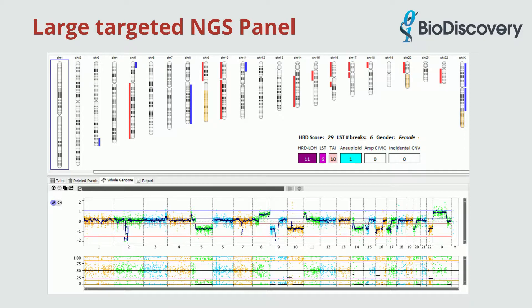In NX Clinical, the genome-wide visualization of chromosomal aberrations is similar to SNP arrays, which enables the HRD analysis approach to be identical, whether the underlying technology utilized is SNP array or NGS.